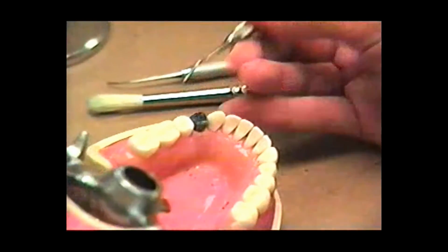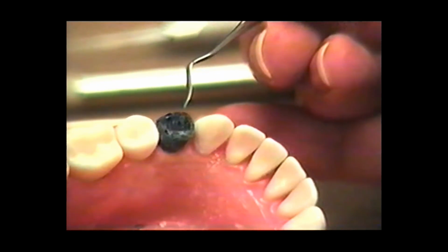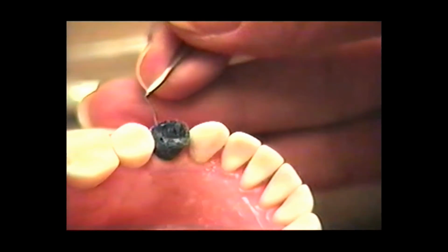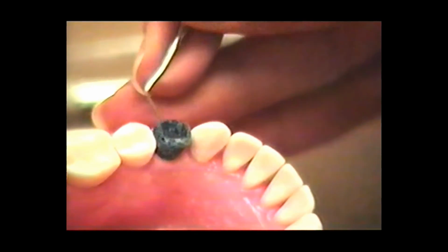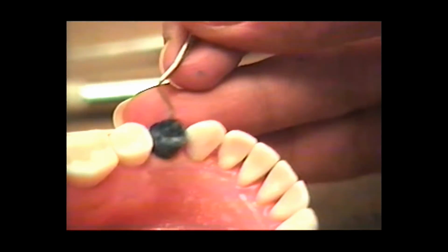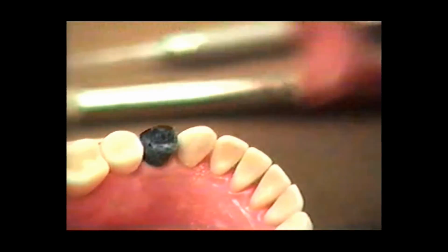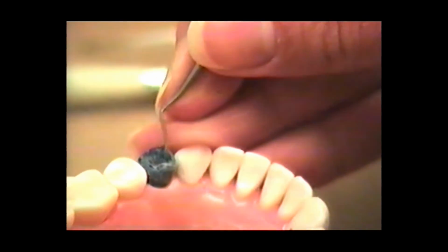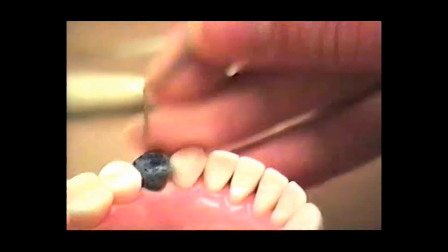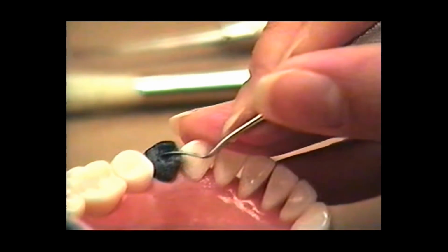Sometimes what happens when you do this is you see that you are really high. This is the case here. We're really high because we've got a contact here. Now we're picking up a contact here and here. So we're going to take this one back here because we don't want one here. And I'll probably take back the cusp tip contact just a tiny amount because I'm still denting into the wax. And then that triangular ridge was still a little high. The marginal ridge contact is still there and it looks good, so I'm going to leave that. And as I do this, I clean my instrument and then just take out any little excess bits of wax.